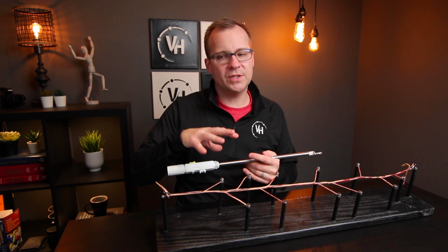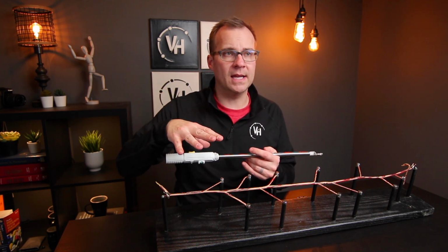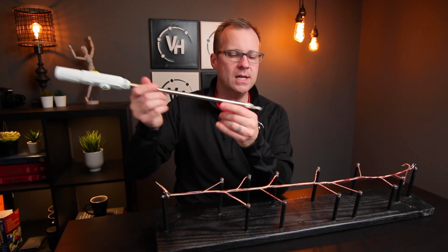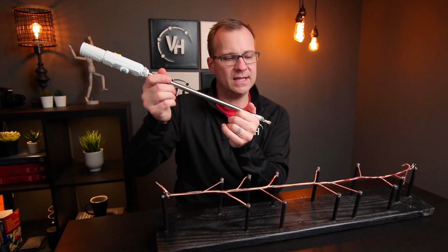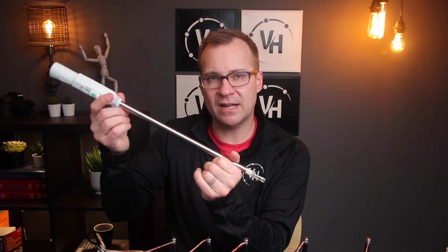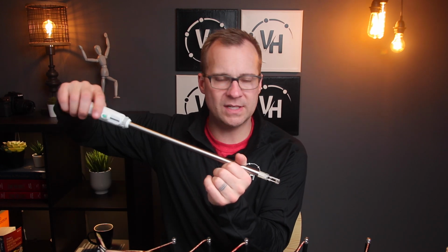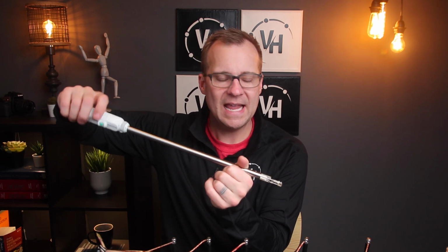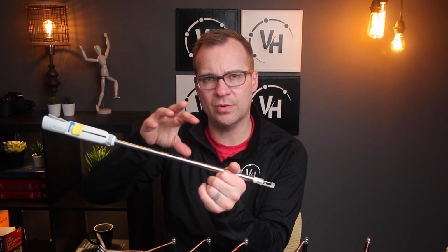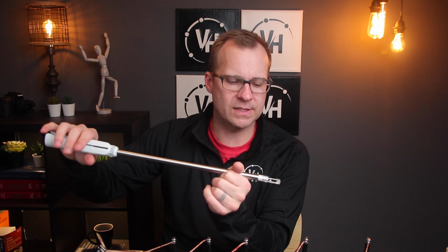Sometimes people ask, well, if it's just past the extent of my retractor, can I put my harvester back in and just take some of that tissue? You can, but two things happen. One, as you put your scope back in the tunnel, and maybe it's only this far, you don't have a lot of tunnel holding your scope up. And so it's really difficult to maneuver and to protect the vein itself as you find that tissue that you need to cauterize. And it's hard to line everything up and create the tension, or the angle, that you need to get that cautery across there.